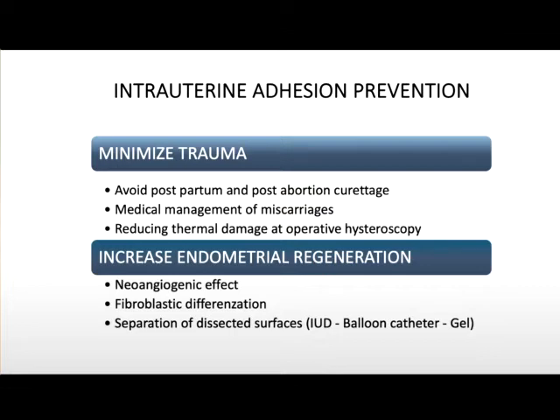The shaver minimizes trauma, and of course you can minimize trauma by avoiding the D&C after abortions, by preferring medical management of miscarriages, but anyhow you have placental remnants even if you do the medical treatment. What is important by using the shaver is that you reduce the thermal damage at operative hysteroscopy. This is the key point of the shaver use.